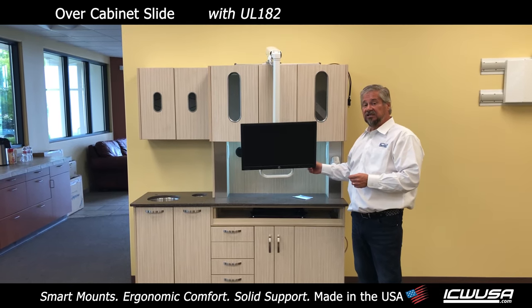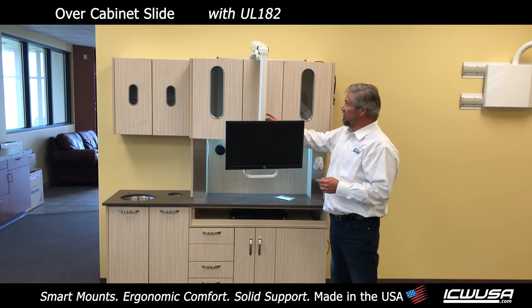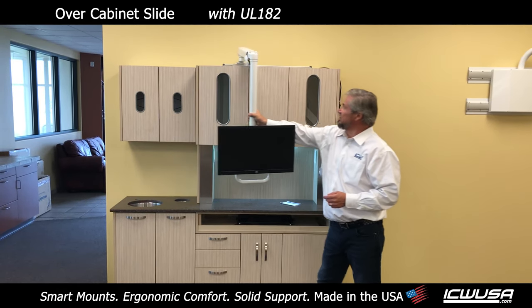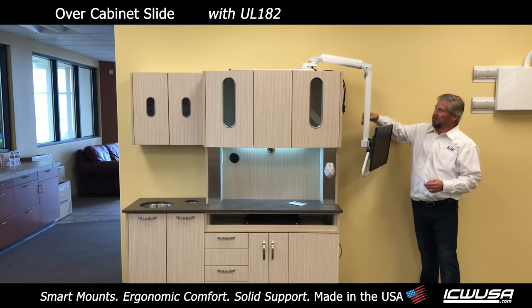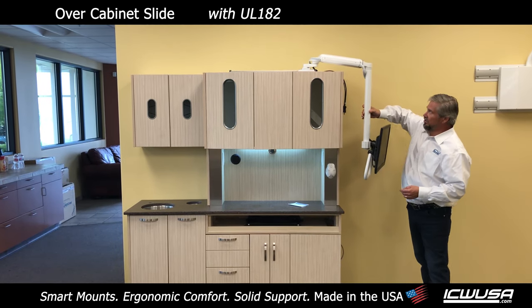This is designed for the dental industry, but has other applications as well. The great thing about this is that it has a slide across the top so you can actually slide the monitor mount back and forth and around the corner. Around the corner is important because then you can open your cabinets and get access to all your cabinets.